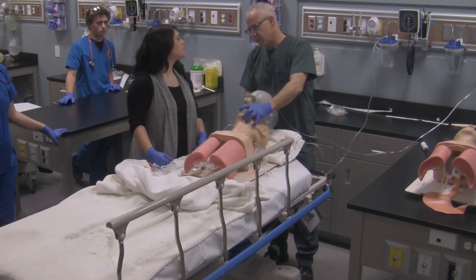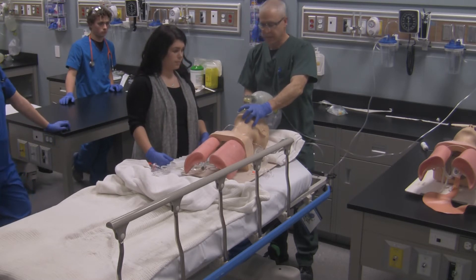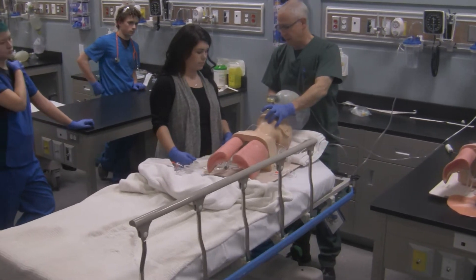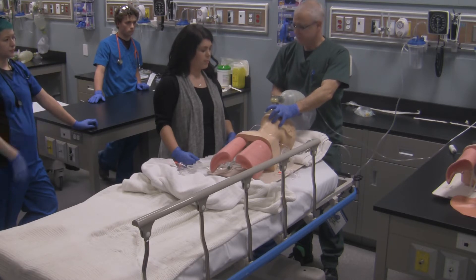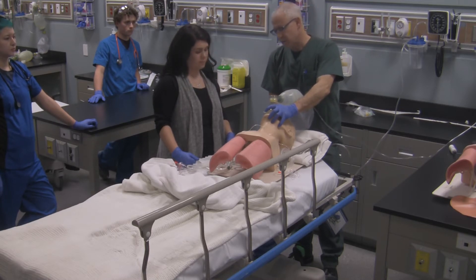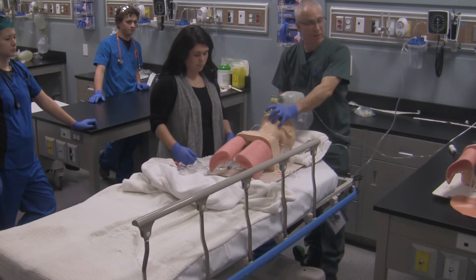Brittany, we're going to put the tube in now. I'd like you to switch over from bag valve mask to bag valve tube ventilation. When the tube's in, I'll secure it and take the stylet out. Can you attach the syringe to the pilot balloon line? You'll take the stylet and I'll take the syringe — if I'm late, just take the stylet out yourself and make sure the tube's secured. One to two minutes have gone by, sats are good, vital signs are good.